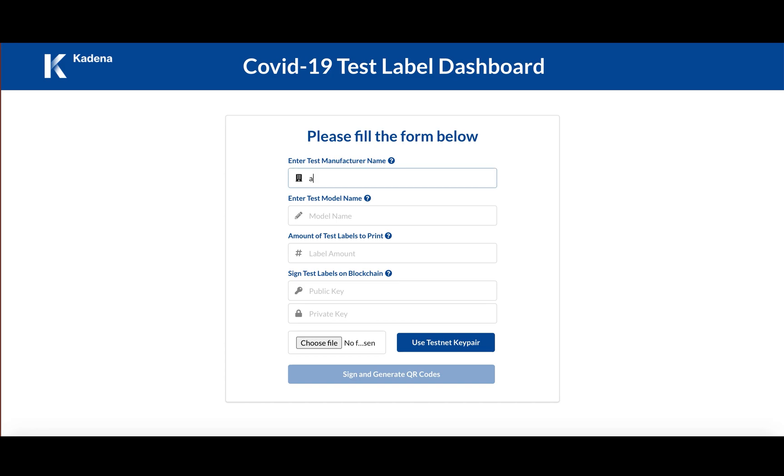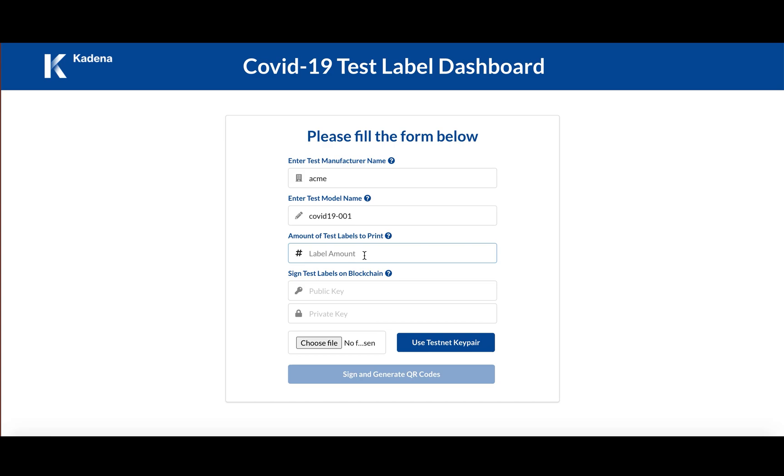So let's say we are ACME. The model name for the test we're about to distribute is covid19-001. And here we register the amount of test labels that we want to print, the QR codes that I just mentioned. In this case we'll go with 50 tests to register.